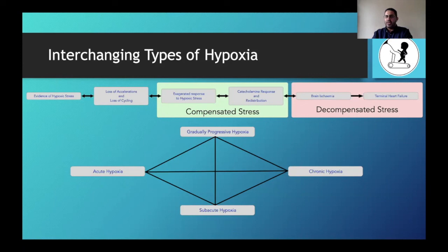It's going to have 10, 15, 20 decelerations before we even pay attention, another 10, 15, 20 decelerations before we manage to improve it. This baby can jump a step, so it can end up with decompensation before it ever gets the chance to secrete adrenaline.